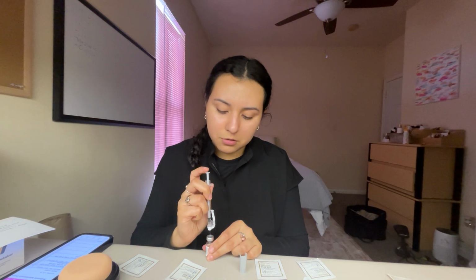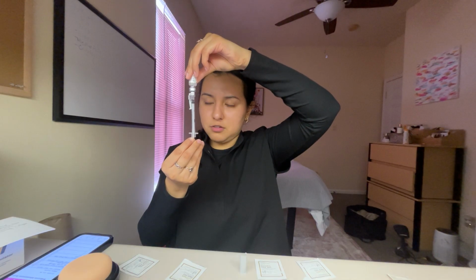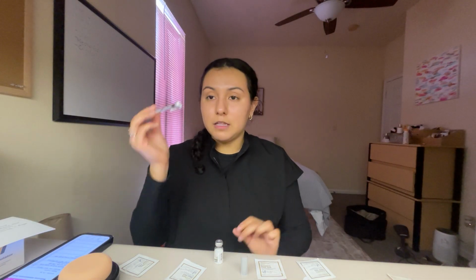I'm going to hold it still, and then I'm going to inject the air, making sure it doesn't touch my solution. Then I'm going to invert it, and I'm going to make sure also that the tip of the needle remains below the fluid level.